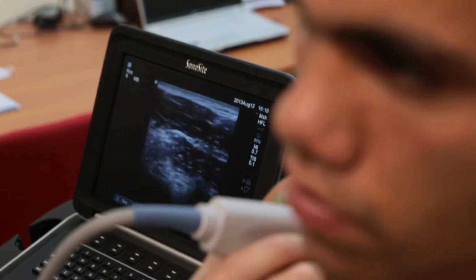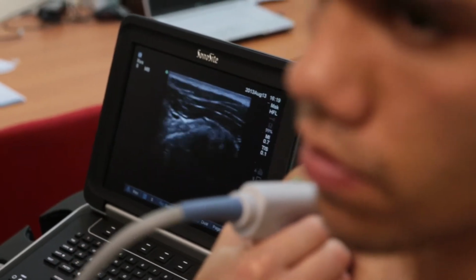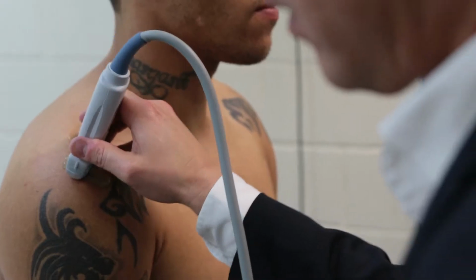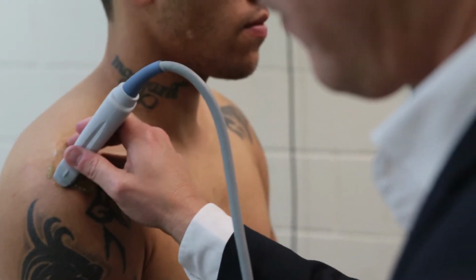So we have the SonoSite Edge ultrasound machine for our game day ultrasound at Fremantle Dockers, and we find the system incredibly useful for management of soft tissue injuries as well as diagnosis of injuries. In particular, one of the major utilities of the SonoSite system is being able to visualise soft tissue injuries, particularly of the upper limbs and also the lower limbs, very clearly.